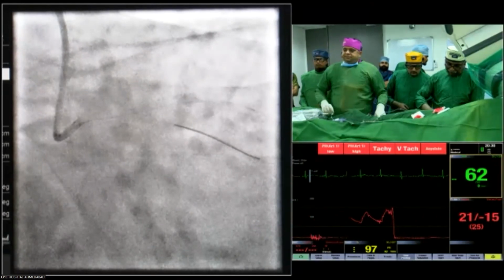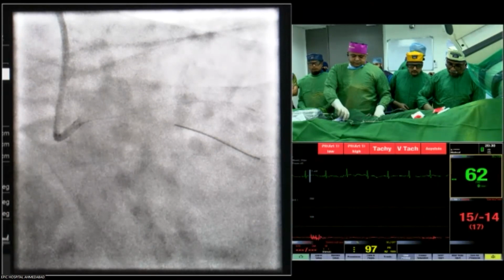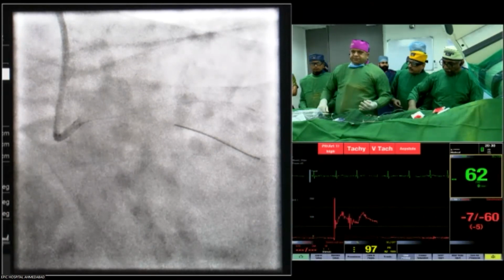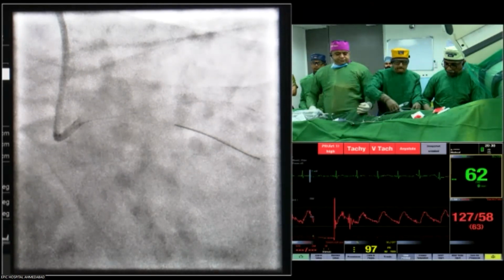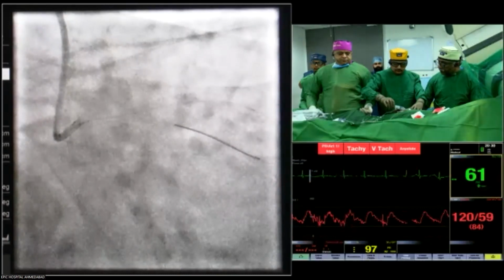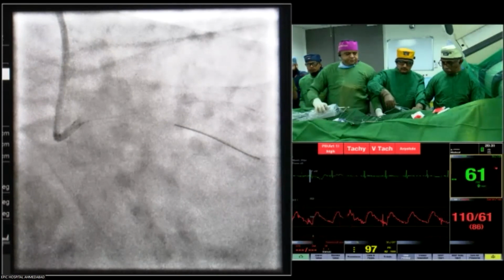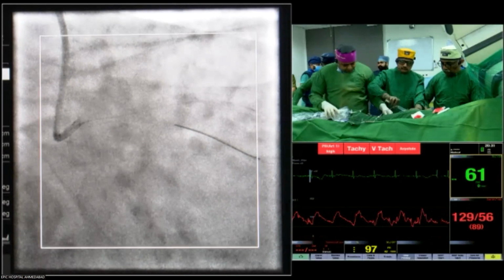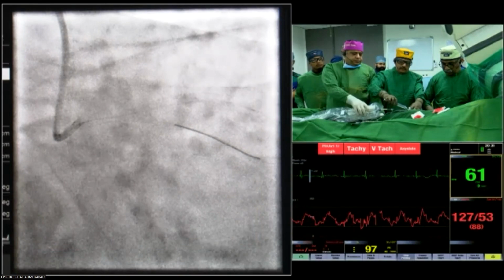No, we thought you had enough room for the ostium. Yeah, correct, that is what placement. Exactly, with the first OCT run we were quite confident we had enough room in the ostium, so we could put the proximal marker right opposite the circumflex and then nail the ostium. That is what we thought also. You felt you had enough room to land. Sort of, actually in any ostial LAD lesion, when the patient comes back with restenosis, the chance of high restenosis is definitely there.